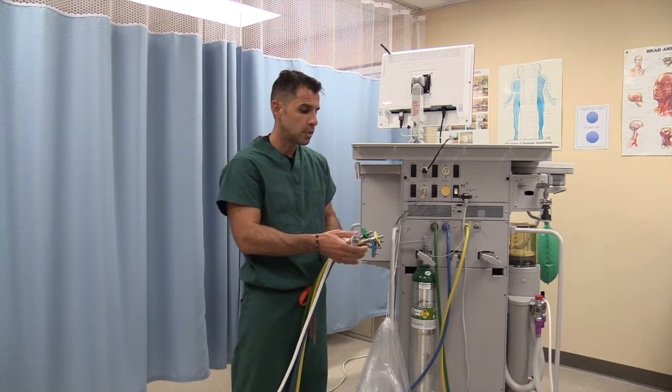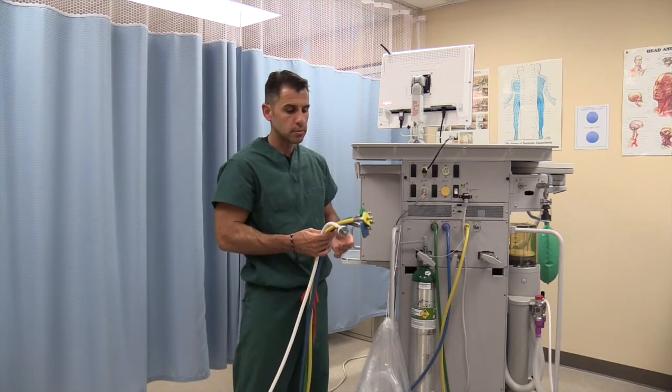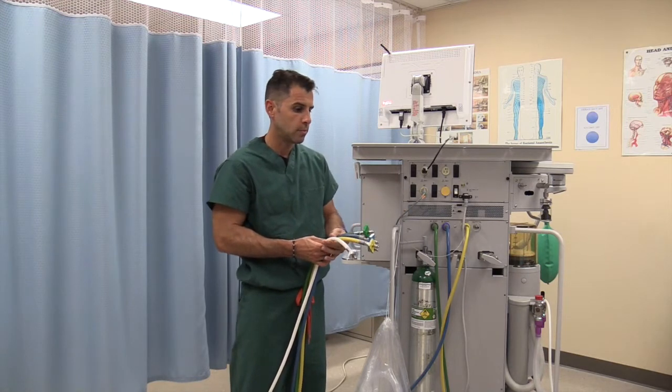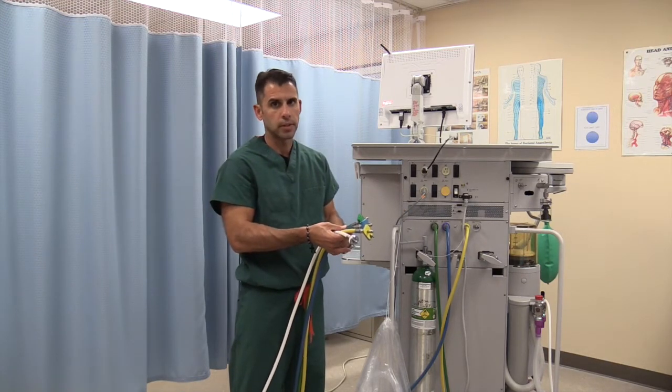In the back of the anesthesia machine, you will find three hoses — sometimes four, sometimes three, sometimes two. But universally, all the hoses are color-coded.